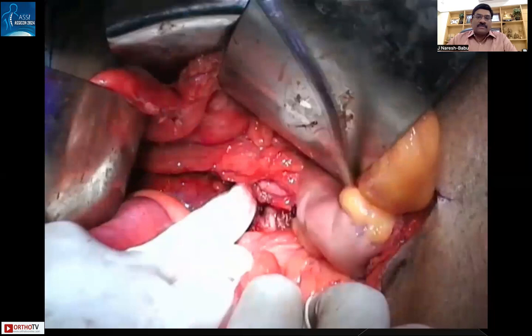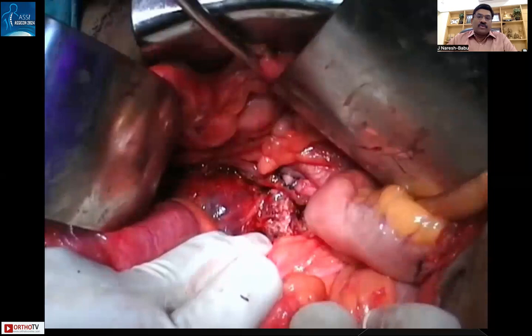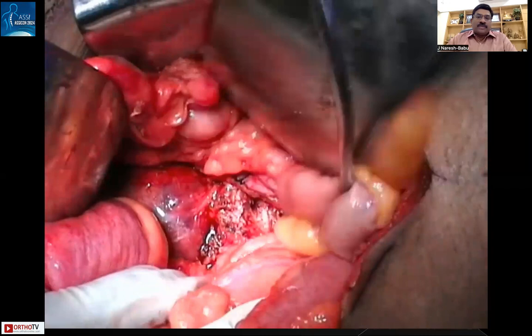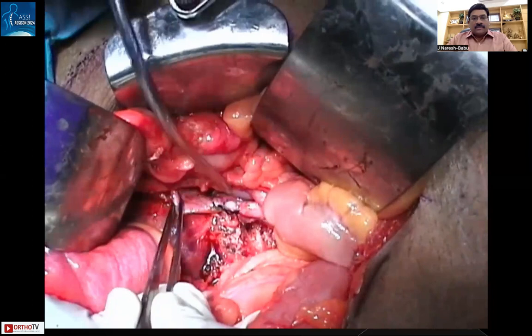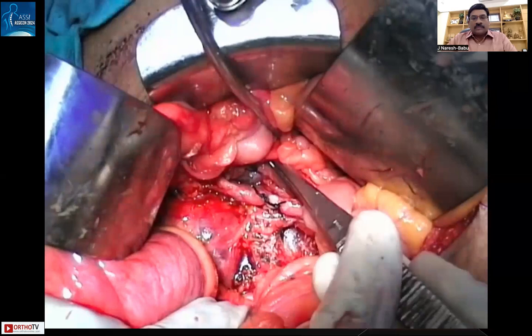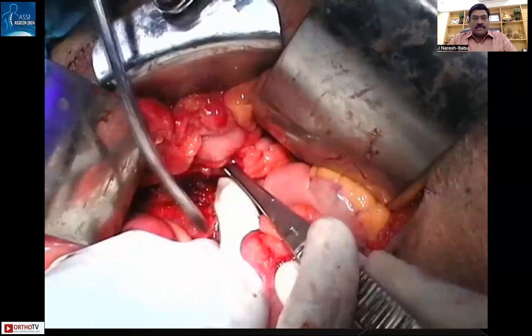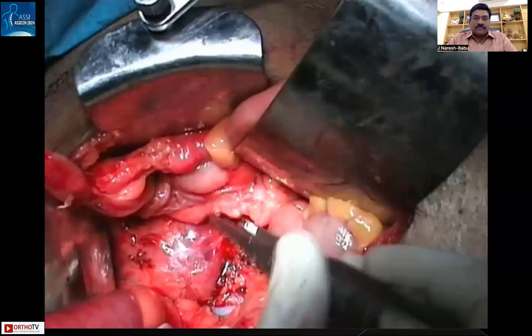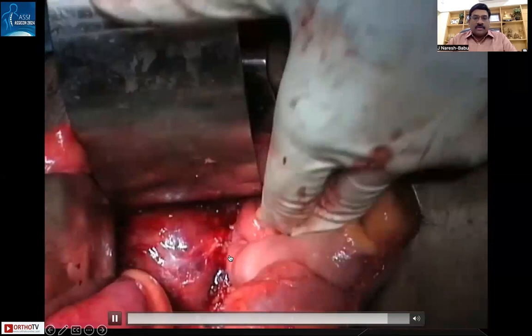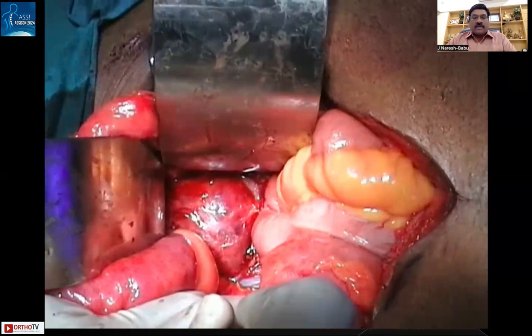Here you can appreciate both the internal iliac artery and internal iliac vein which were ligated to render the tumor bloodless. For lesions below S2, ligation of these vessels is not required and the procedure can be done posteriorly. The rectum is mobilized so that tumor removal becomes easier. Ligation of the vessels on the contralateral side is similarly completed, concluding the anterior procedure.